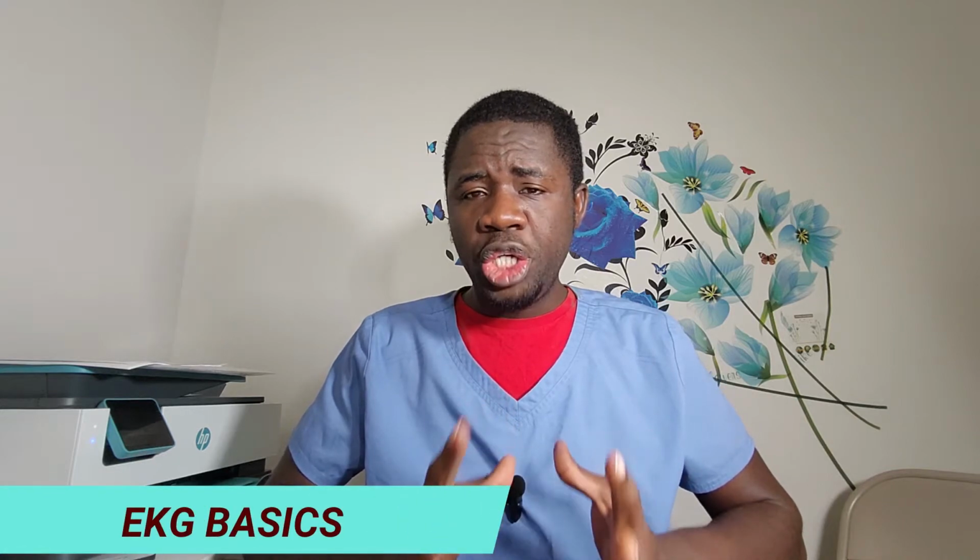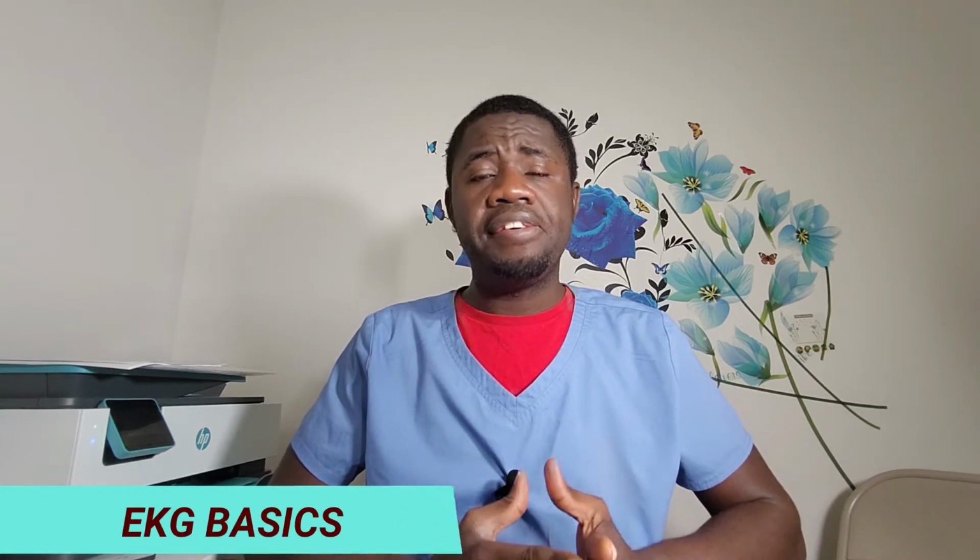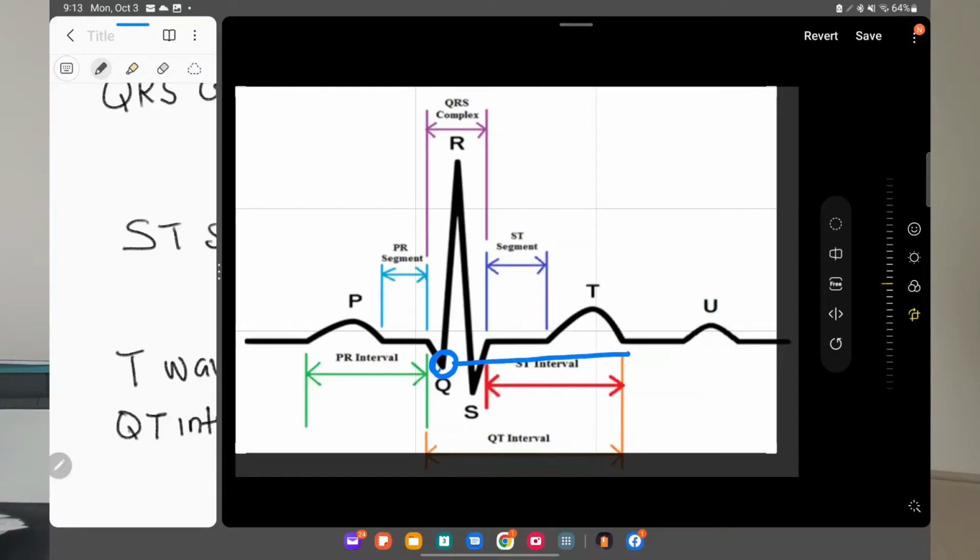The QT interval is another thing to consider. It is measured from the beginning of the QRS complex to the end of the T wave. The QT interval is very important to monitor, especially in patients who are prone to having prolonged QT intervals.